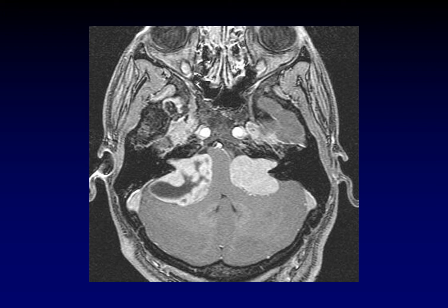Hopefully we all know what this is. There are bilateral vestibular schwannomas here, and even if you didn't have all of the other schwannomas and meningiomas along the fifth cranial nerves here, you can see spreading forward along V2, etc. Even if you didn't have all these others to clue you in that this is a systemic problem, the presence of two vestibular schwannomas, bilateral vestibular schwannomas, that in and of itself is sufficient to establish a diagnosis of neurofibromatosis type 2.